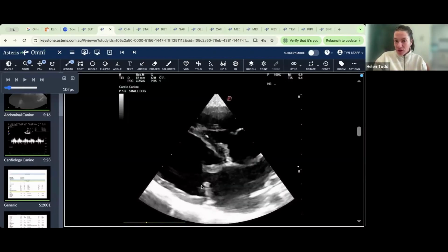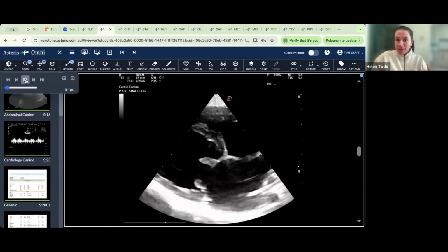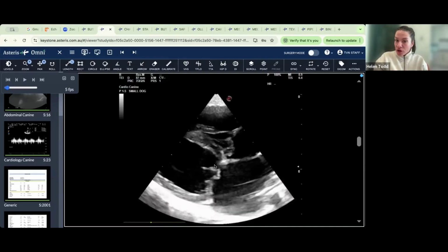As these mitral valves close, the leaflets, can you see how my mitral valve actually comes around and then actually prolapses into the atria before coming back out? It's a really subtle little movement. But we would make the comment, just subjectively looking at this mitral valve, not only is it thickened and irregular, but it's actually prolapsing into the atria when you watch it slowly.